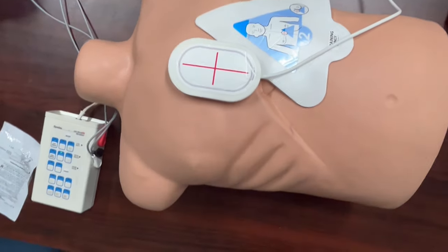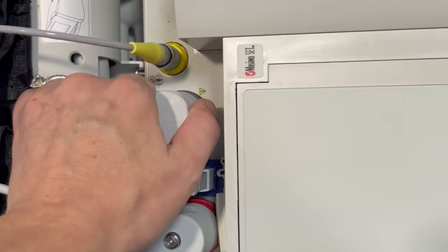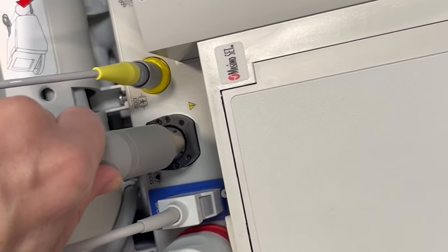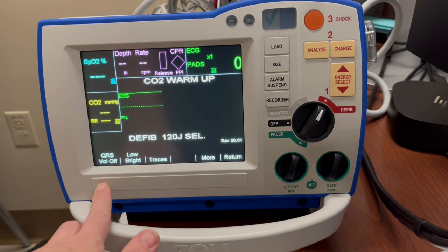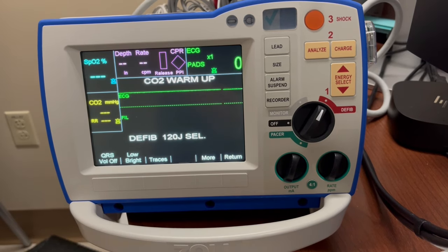If for any reason you cannot turn the patient and put the pad on the back, there are alternate pad placement positions. If you use those positions, you will need to use the three-lead EKG connected to the monitor — take out this plug and plug the EKG leads in here. To silence the heart rate on the machine so it's less disturbing, go to Options, QRS Volume, and decrease the volume.